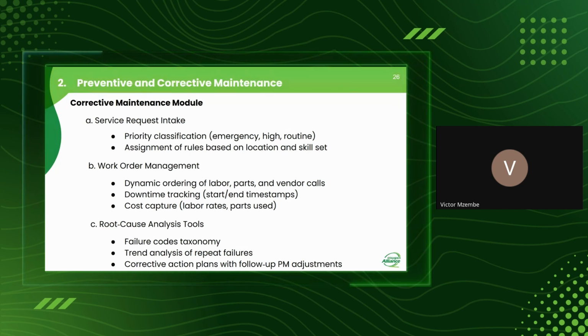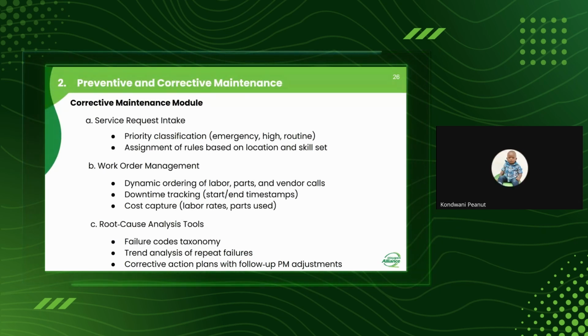So I can give an opportunity to one more question. Engineer Kondwani, you have something to say? Yeah, I just wanted to add on what Engineer Brenda said. So really corrective and repair, they are similar. In some cases, the corrective is called demand maintenance. Repair may be called demand maintenance, and the corrective may be called breakdown maintenance.